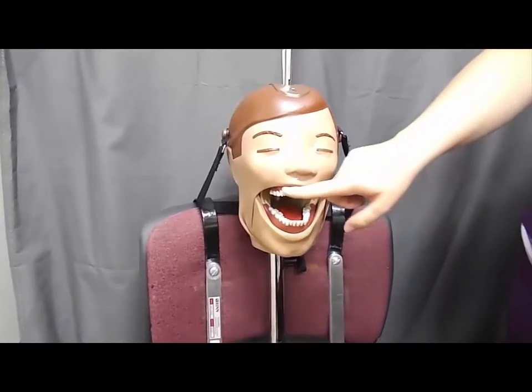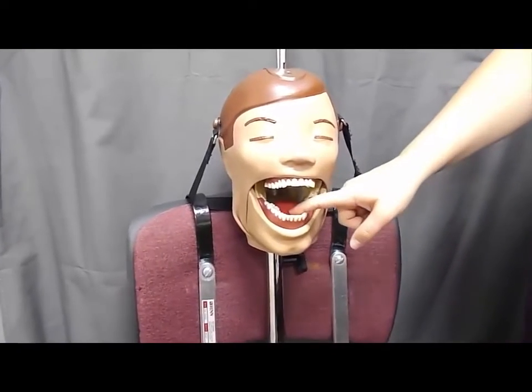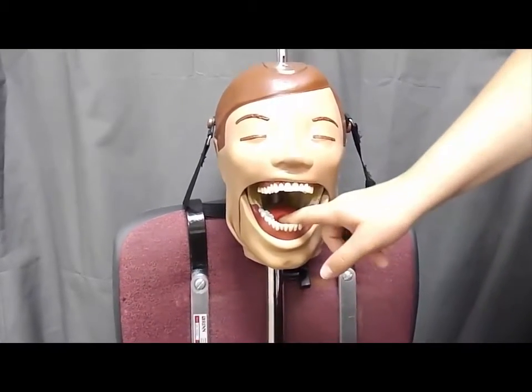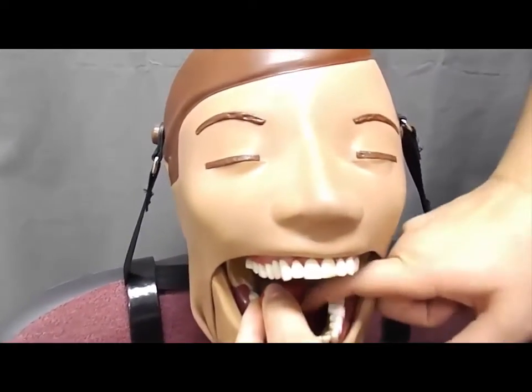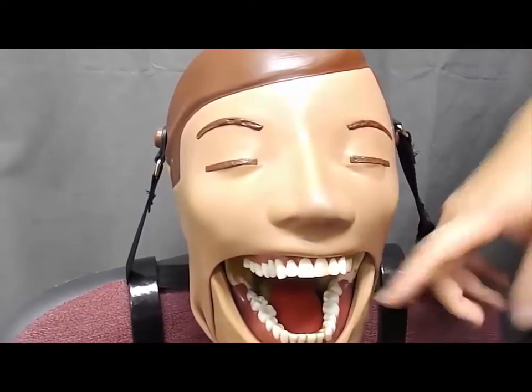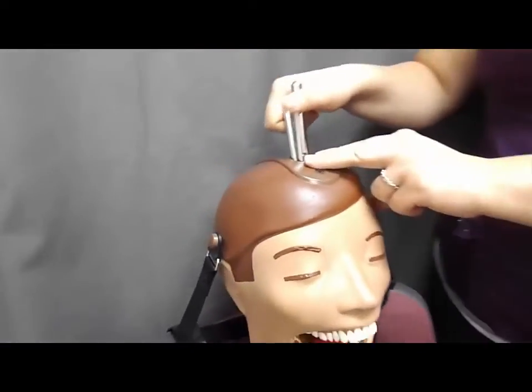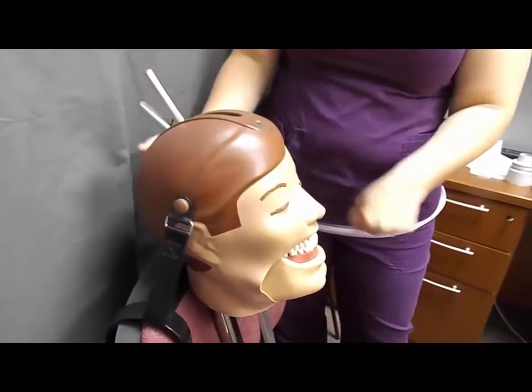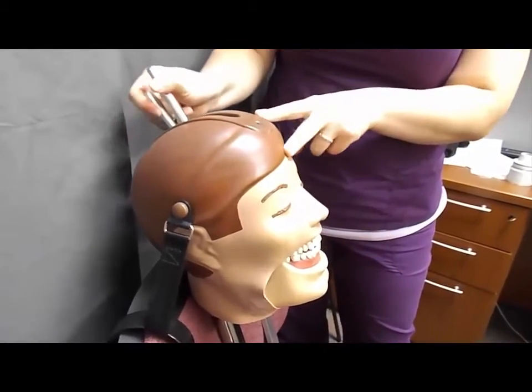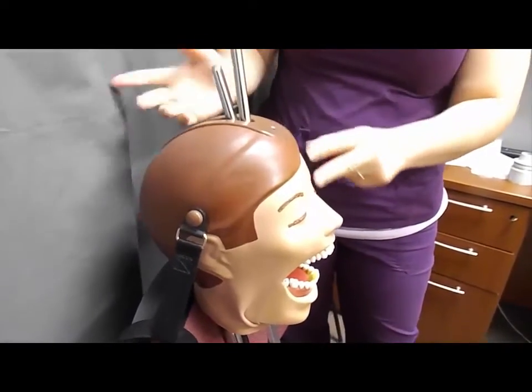Dexter will be your patient when placing the bite wing instrument. The only thing about Dexter is this thick rubber tongue that can get in the way, so be sure that you are maneuvering that out of the way for him. Unlike a real patient, he's unable to move that. We have a handle that closes and opens Dexter's jaw. Simply bring it back and it will lock closed; push it forward and his jaw will stay open.